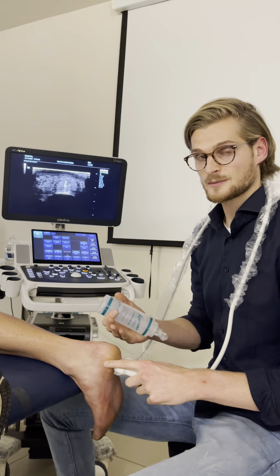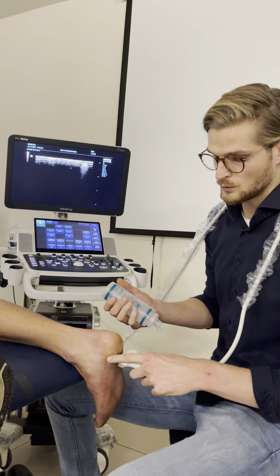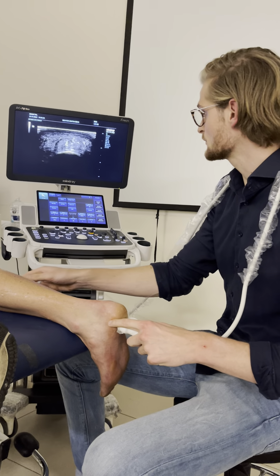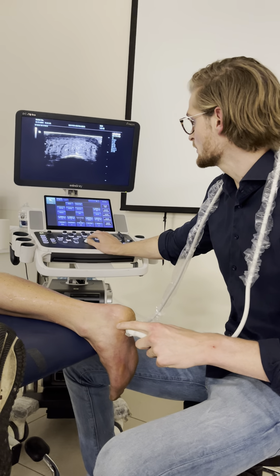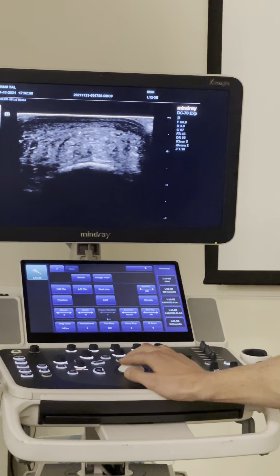We're going to do a measurement of the fat pad of the heel, but first I will mark a little bit of my location. This will be my location for the short axis view of the calcaneal bone. A little bit of plantar fascia over here, and this is just all fat layer.